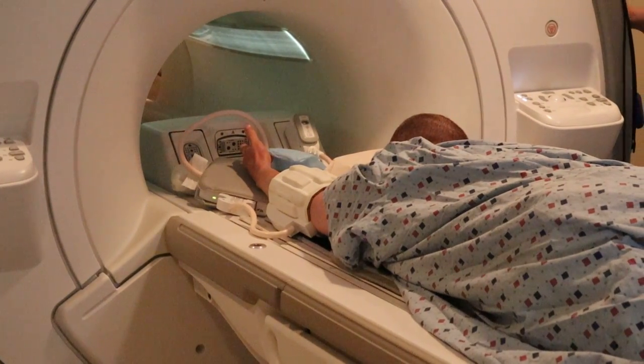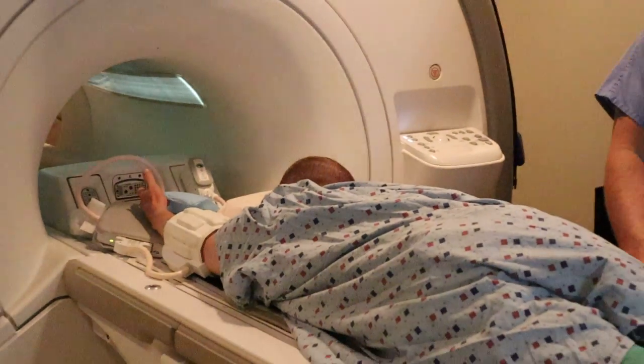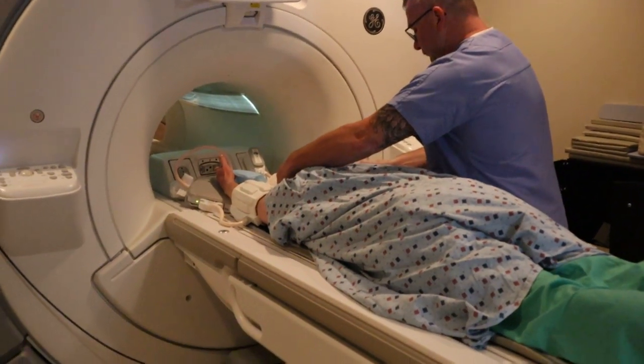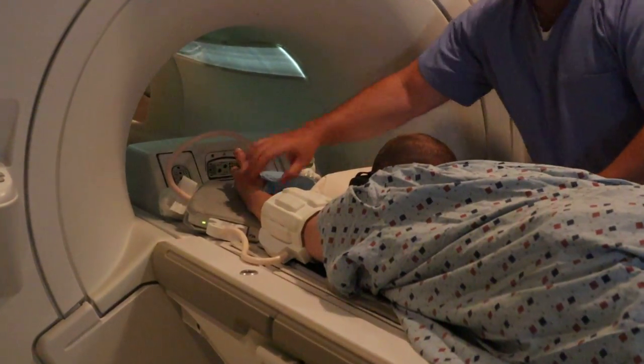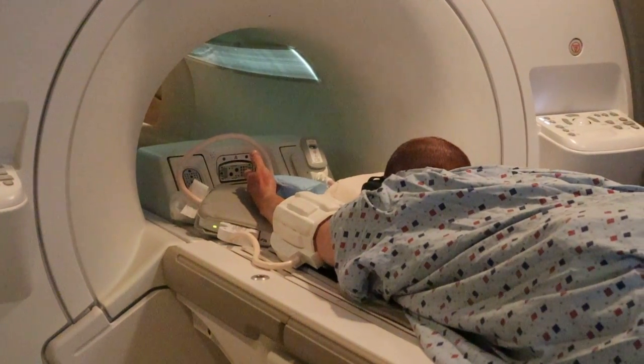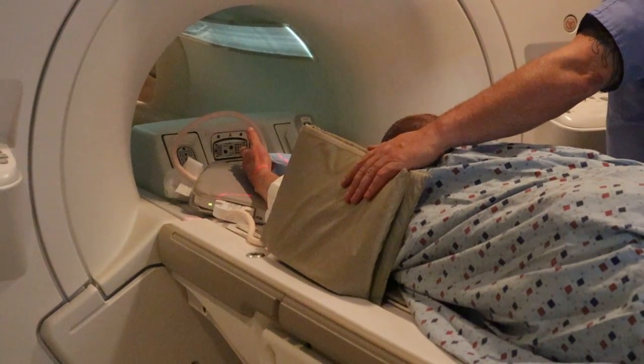It's always good to remember patient to coil, coil to magnet. You're going to give them the emergency ball and provide them with headphones to communicate with the patient. Anatomical position on the hand, and cushioning to ensure that they're not touching the bore.